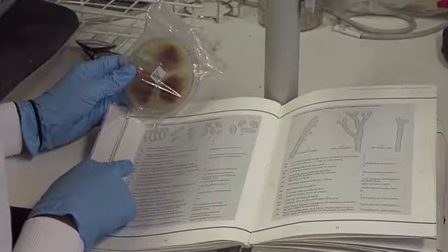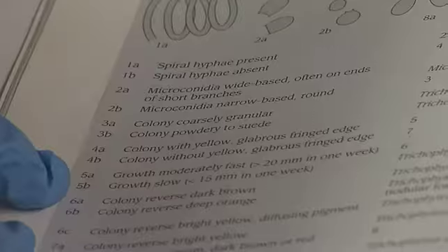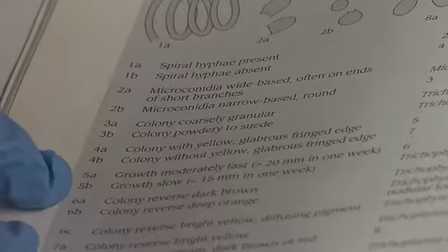This isolate shows small round clusters of microconidia and spiral hyphae, together with larger cigar-shaped macroconidia, and alongside its colonial appearance, it would be identified as Trichophyton interdigitale. To help identify fungi, the Health Protection Agency textbook, Identification of Pathogenic Fungi, is also often used.